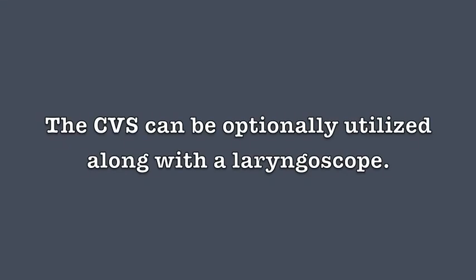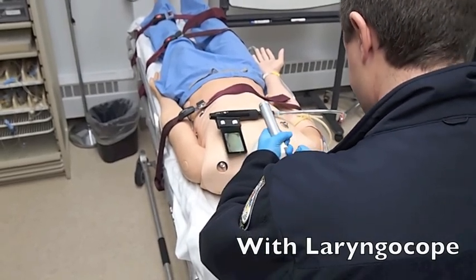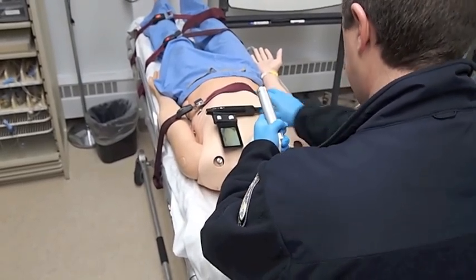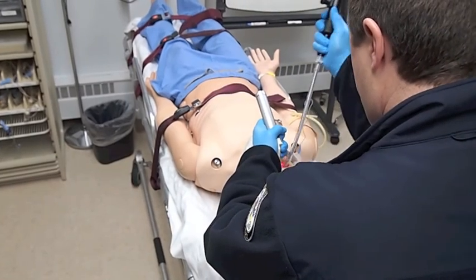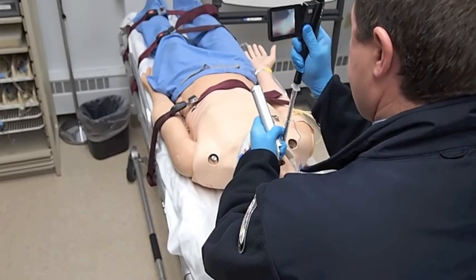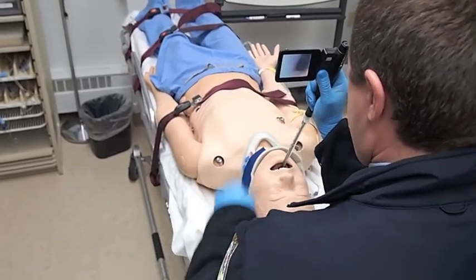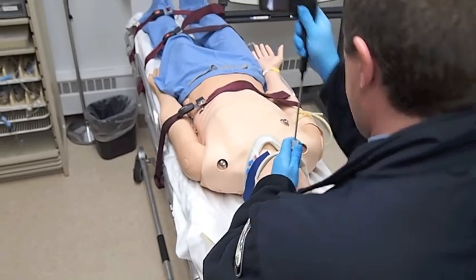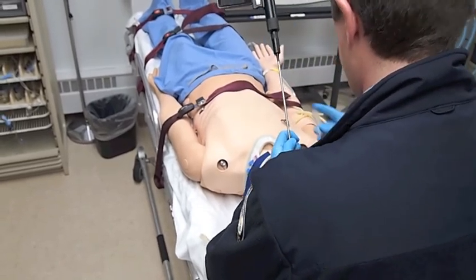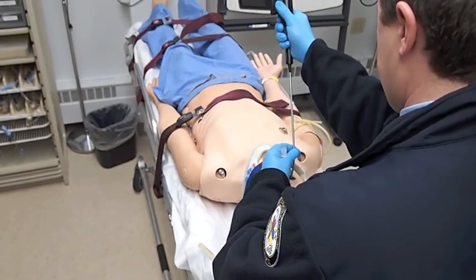The Clarus videoscope may optionally be utilized along with a laryngoscope. Utilizing a Macintosh blade, sweep the tongue, lift the mandible, place the CVS midline, and utilize the system just as you would if you did not utilize the laryngoscope. Remember to inflate the balloon, remove the device, and check placement.